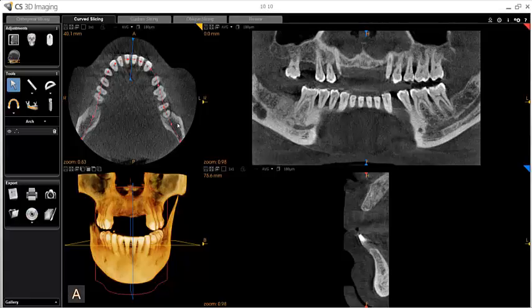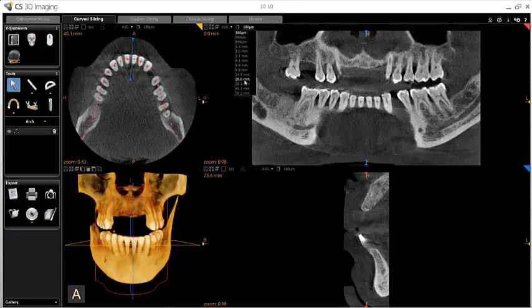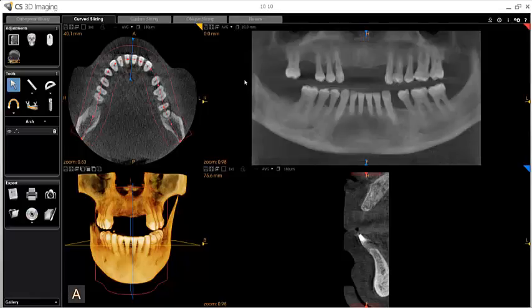The full reconstructed panoramic image will now be displayed in the upper right, and the transaxial cross section is below it. The panoramic image may look a bit strange, as it's displayed as a curve with the slice thickness at the scan's native resolution — in this case 180 micrometers. To make it look like a more traditional radiograph, you can use the Set Integration drop-down to increase the slice thickness. Use the same tool to change it back.